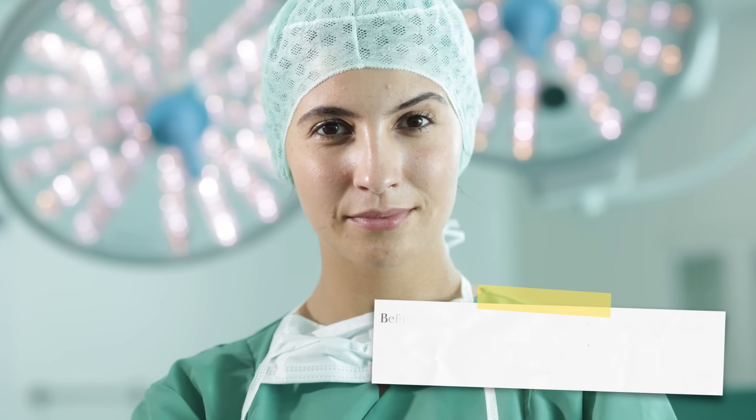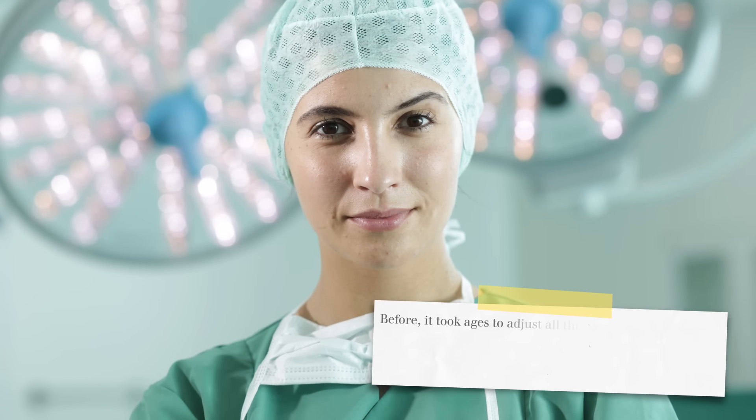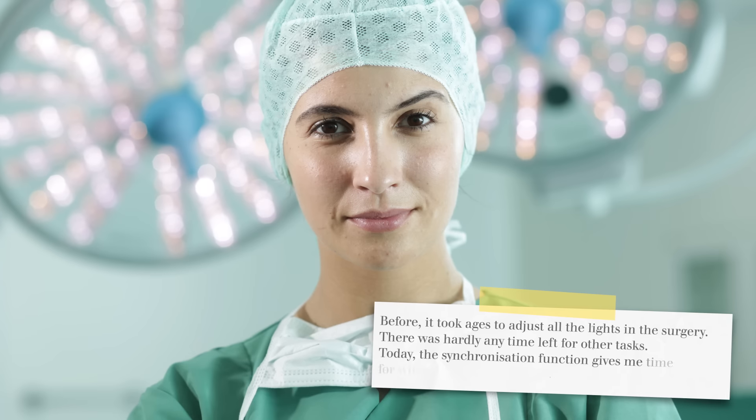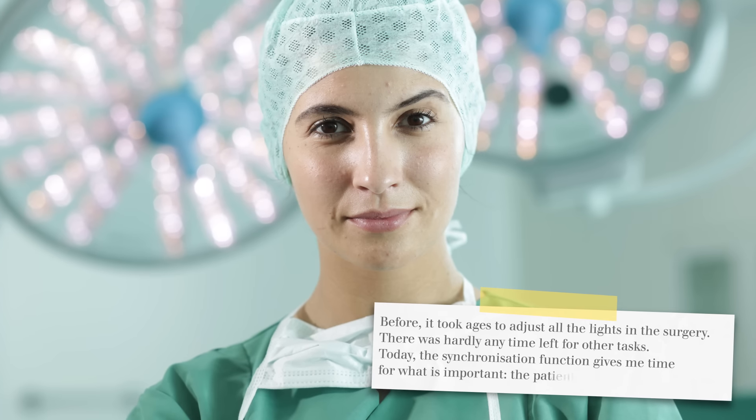Before it took ages to adjust all the lights in the surgery and there was hardly any time left for other tasks. Today the synchronization function gives me time for what is important — the patient.